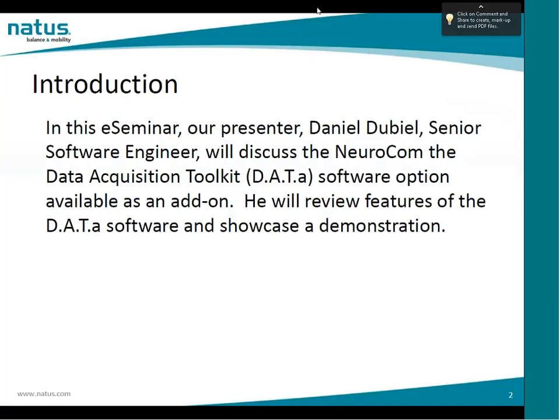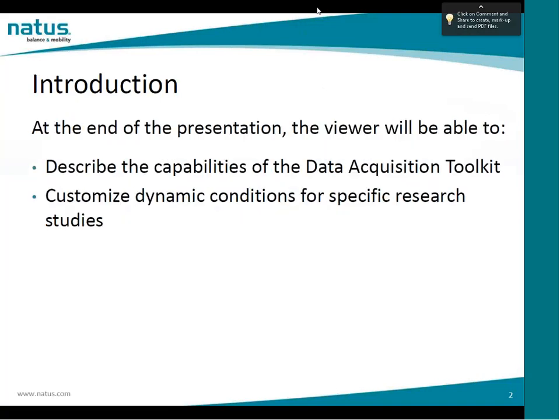In this eSeminar, our presenter Daniel Dubiel, the Senior Software Engineer, will discuss the NeuroCom Data Acquisition Toolkit software option that's available as an add-on. He will review features of the data software and showcase a demonstration.